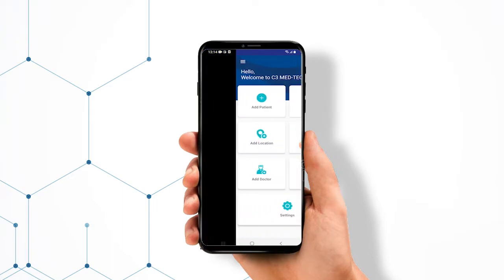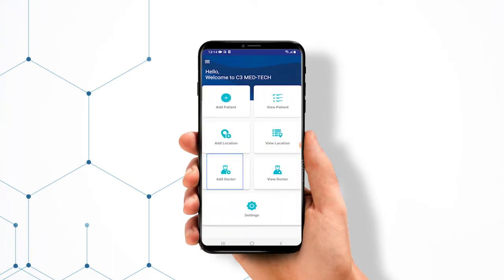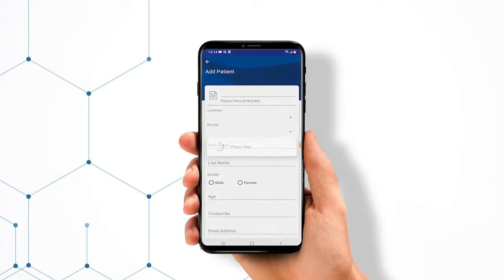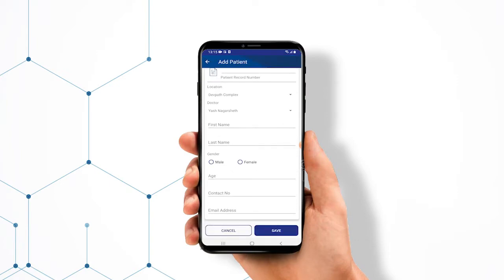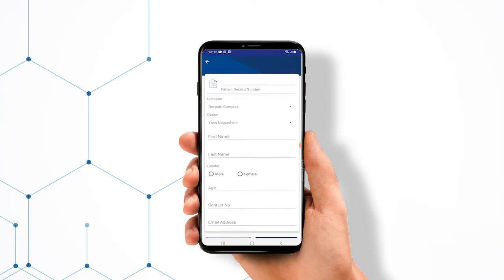You can add the examiner's info, location info, and the patient details. Click on the Add Patient option. Add the record number, select the location and examiner from the drop-down menu, add all the necessary patient details, and save.